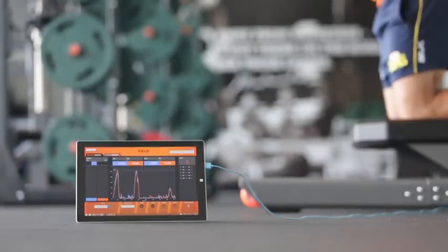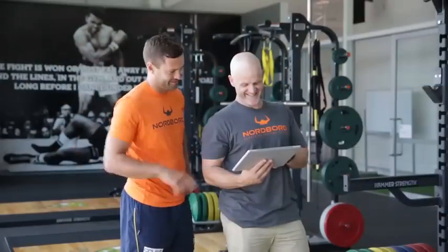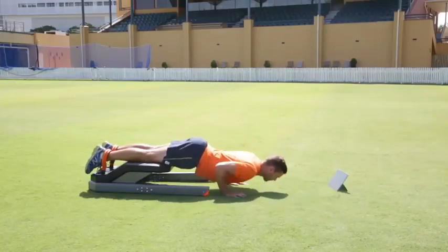Data is captured on Scoreboard, an app designed to allow coaches to give athletes immediate feedback. Using Scoreboard, athletes can even view their performance in real time, giving them additional biofeedback and motivation.